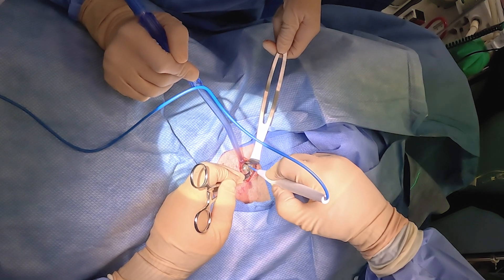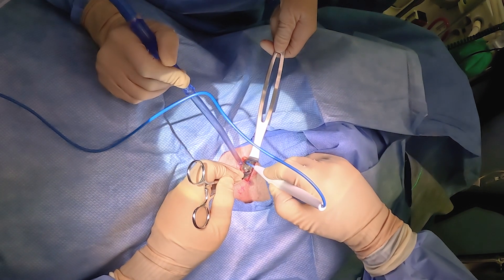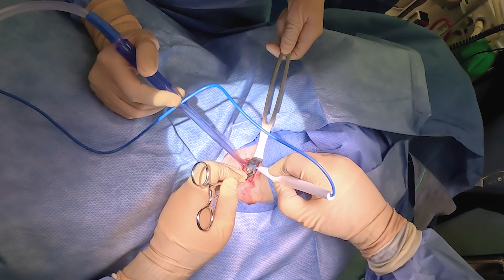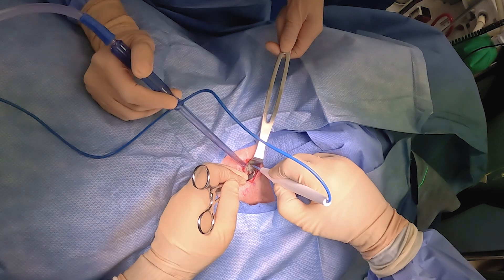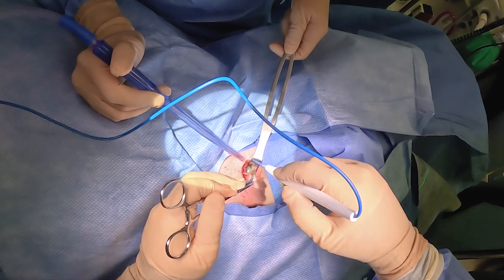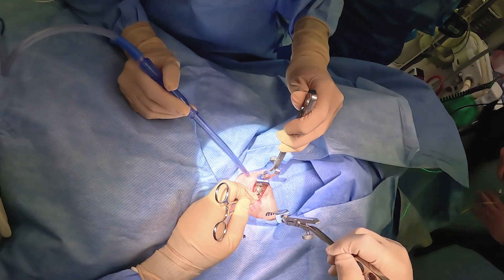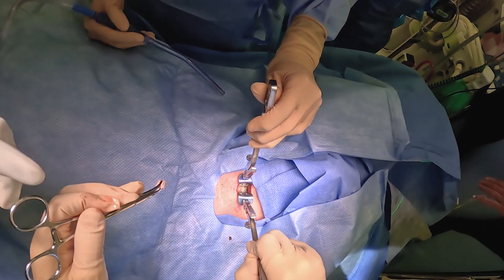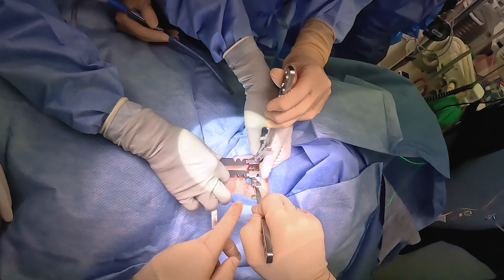What we're seeing here is a standard left-sided approach, much like you would do for a non-previously operated surgery, exposing and just beginning to see the artificial disc, and just getting the exposure ready to put in our retractors. We're putting in our self-retaining retractors, just like in a non-previously operated surgery, and this will get us our exposure so that we can do our work.